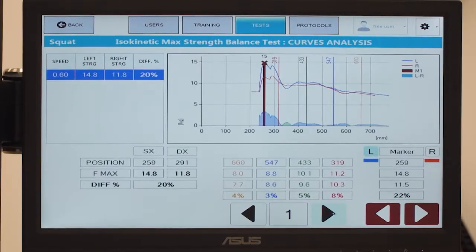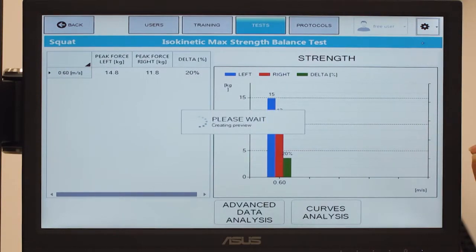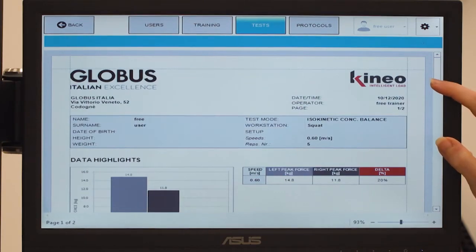Kineo can process the data in histograms — in blue for the left side and in red for the right side — showing the interim difference in percentage in terms of peak strength values.